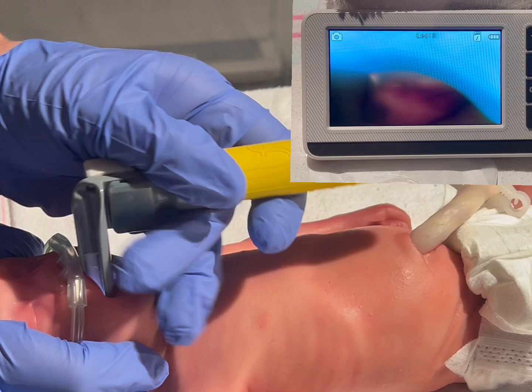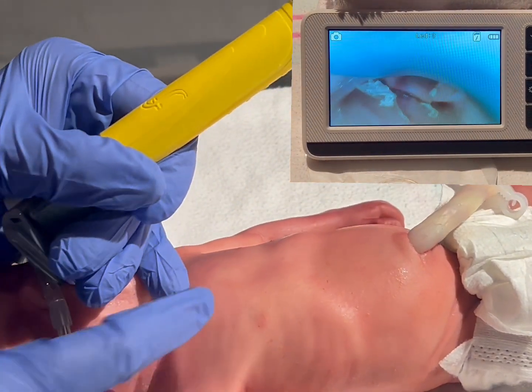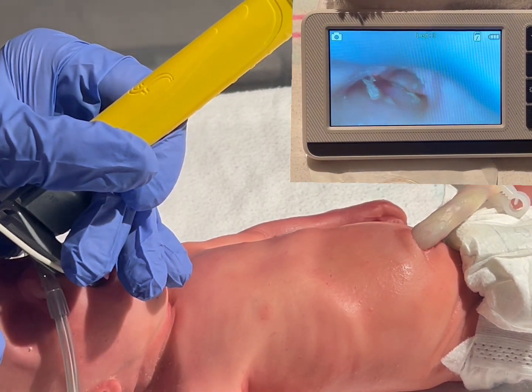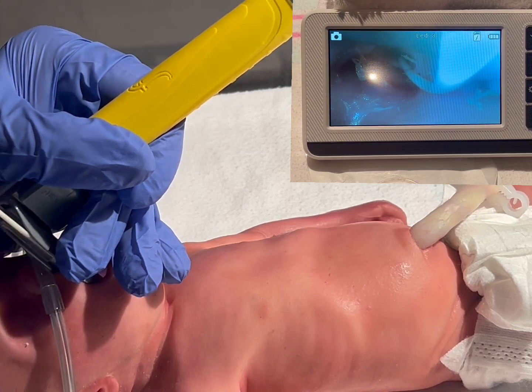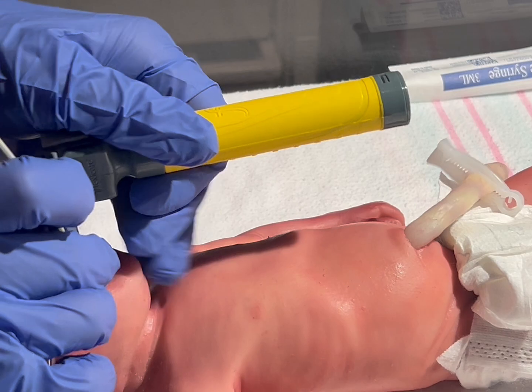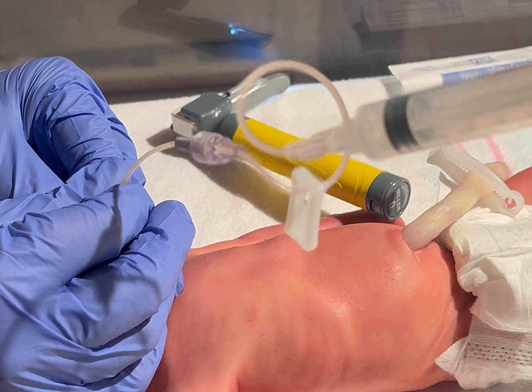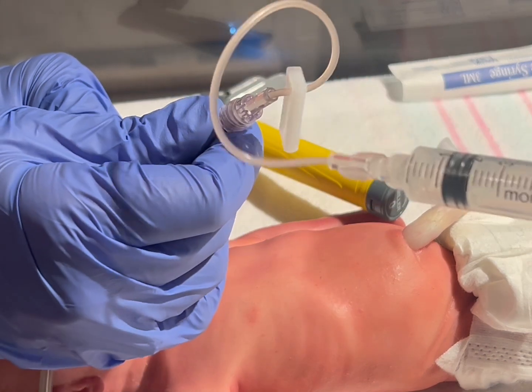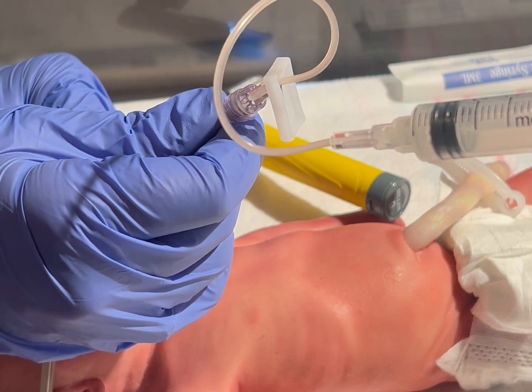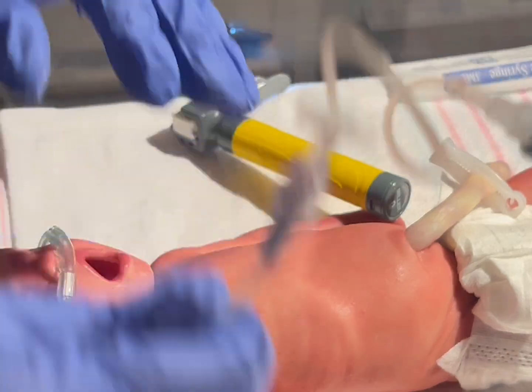To perform LISA, you intubate while on non-invasive respiratory support. You would find your landmarks as you normally would. Once those are found, you then advance your catheter to the point at which the mark reaches the vocal cords. Once you have reached this mark, you stop advancing your catheter and remove your laryngoscope blade. At this point, the RN or RT can attach the T-connector and slowly administer surfactant over one minute, possibly slower if bradycardia or reflux of surfactant occurs, complete with the 1 ml flush of air, then remove the angiocatheter.